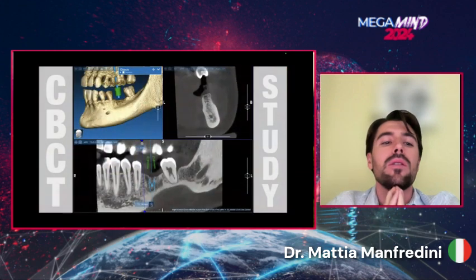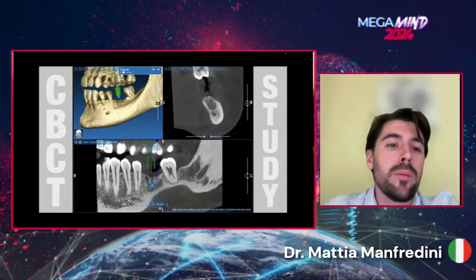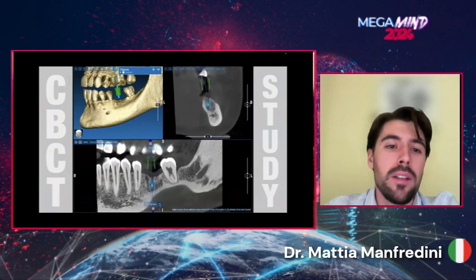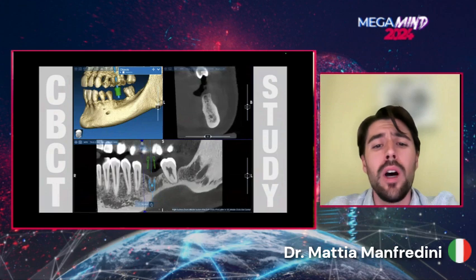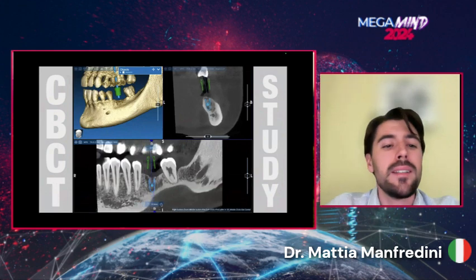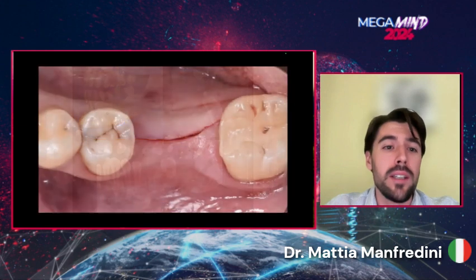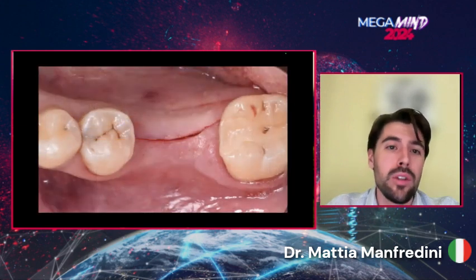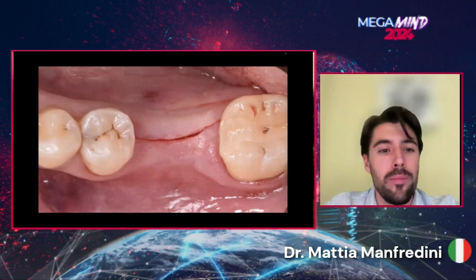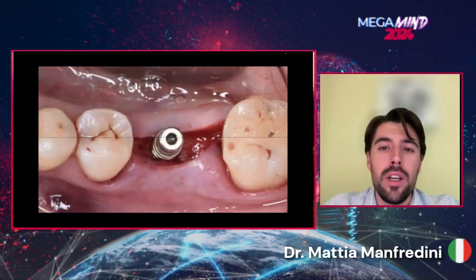You can see the horizontal contraction following the extraction on the molar in this occlusal picture. From the CBCT study, of course, we perform a CBCT study and we project the implant before. We can see that the volume is sufficient to place the implant, but from the previous photo, we can see that it is necessary to manage the tissue to ensure satisfactory aesthetic outcome, because we have a contraction and it's not bone, but it's more tissue. So the flap is designed in order to draw papilla with a C incision and to adapt this papilla to the anatomical chosen abutment.